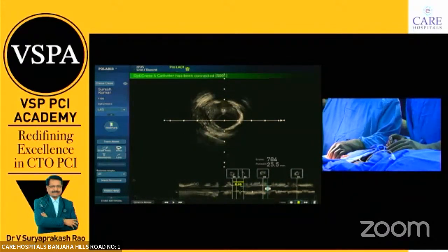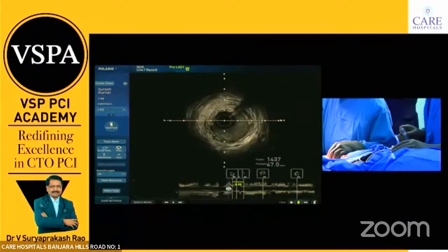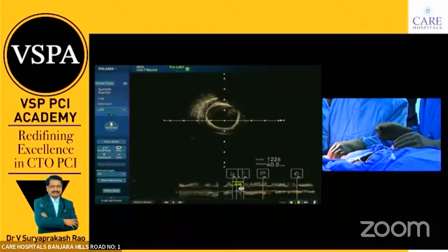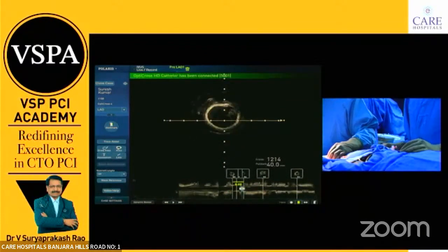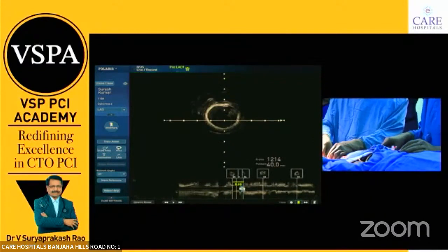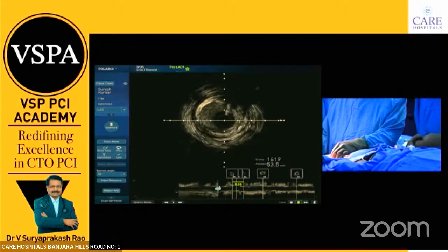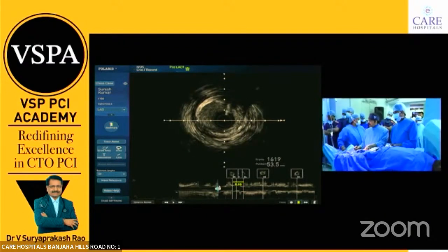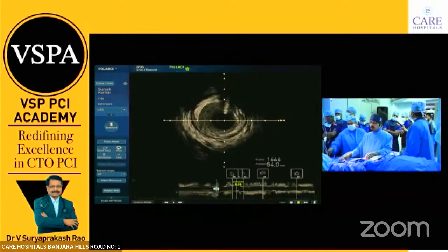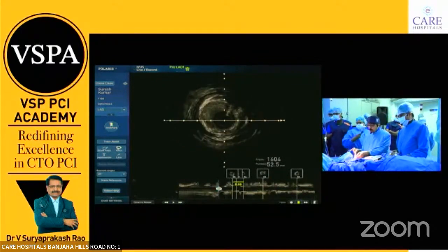What is the size of the proximal portion? 3, yeah. We can take a 2.5 Wolverine there. Do you want a 3 size Wolverine? No, approximately. 3 you can take. Always give a caudal view also so that you are not close to the left main. Caudal, please.